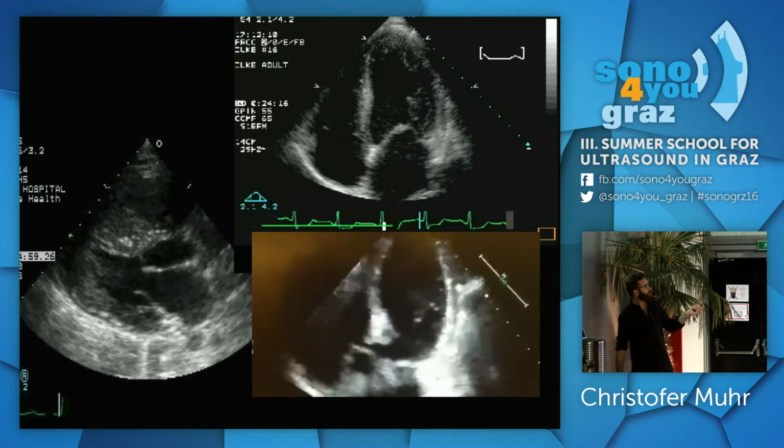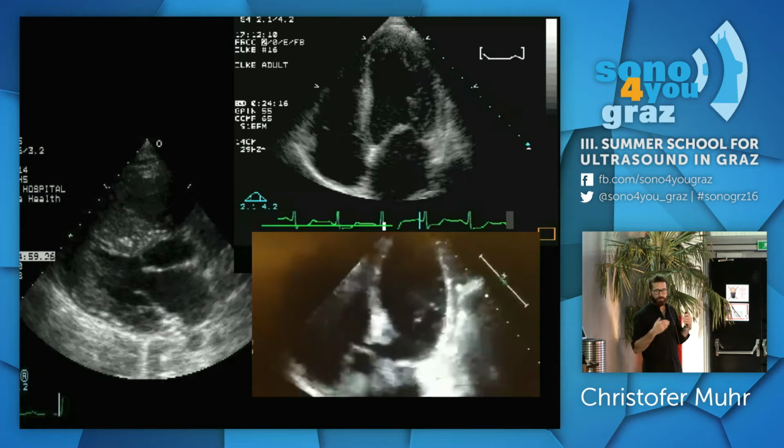And this guy hasn't been taking his hypertension medication, right? Severe hypertrophy, which might result in a left ventricular outflow problem, but also they're super sensitive to hypovolemia, tachycardia, okay? So if this guy comes in with some kind of shock, what we need is to reduce the heart rate and often fill up the heart, right?